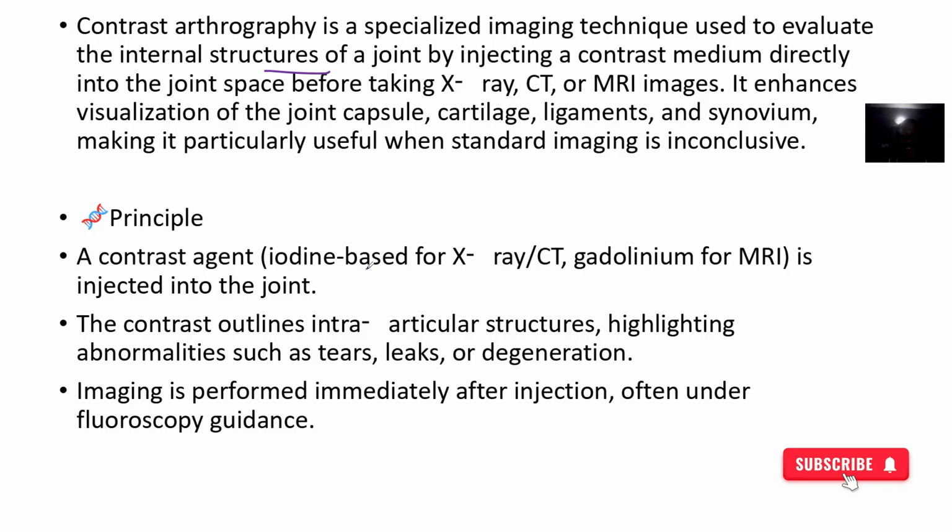So a contrast agent has iodine base for x-rays, CT scans, gadolinium for MRI. They're the ones that are mostly being used. So contrast will outline the intra-articular structures, highlight abnormalities such as tears, leaks, and degeneration. Now imaging is performed immediately after injection.